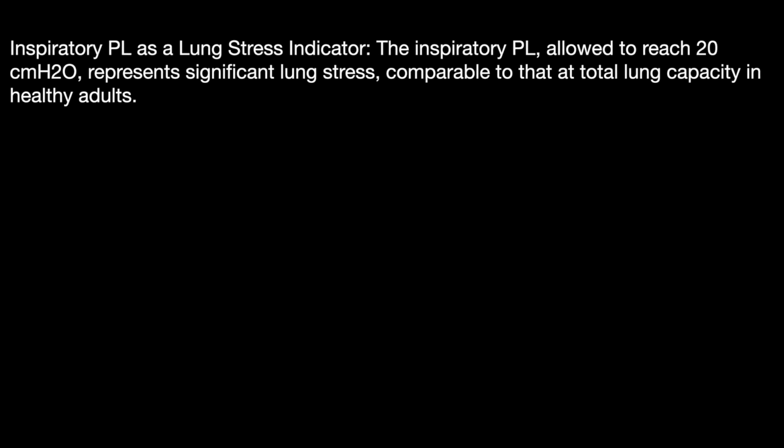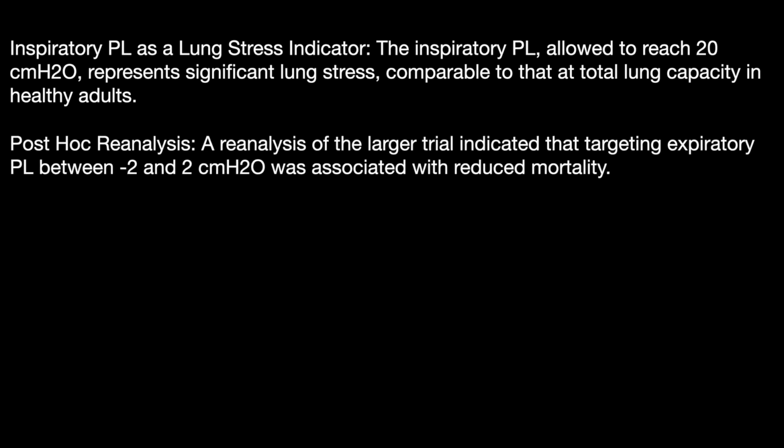Now, inspiratory transpulmonary pressure as a lung stress indicator. We can use this to set PEEP. We can also use it to set the tidal volume. An inspiratory transpulmonary pressure allowed to reach 20 represents significant lung stress, comparable to the total lung capacity in a healthy adult.